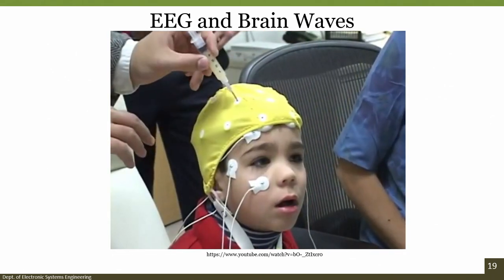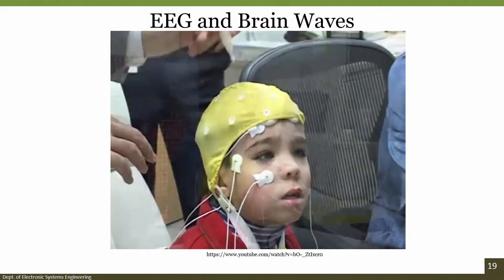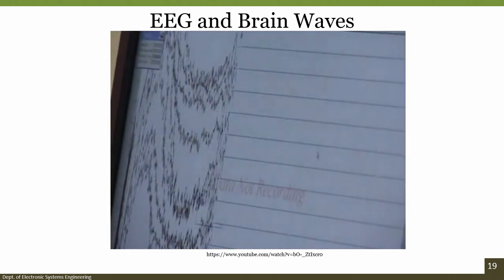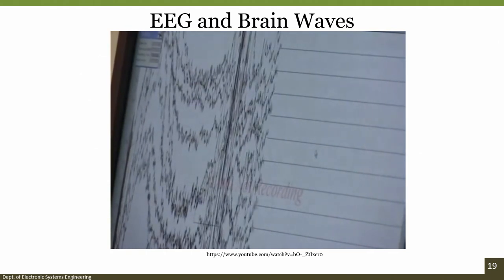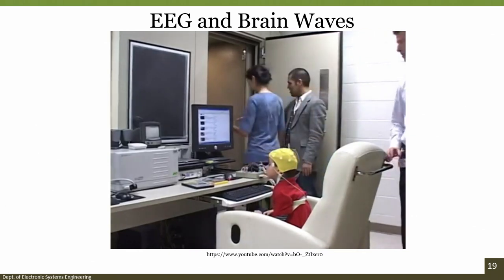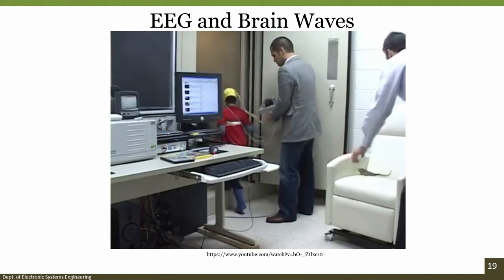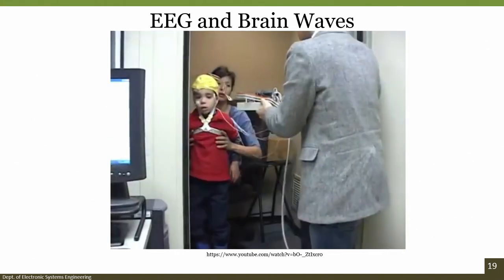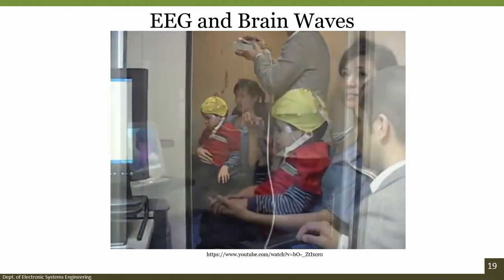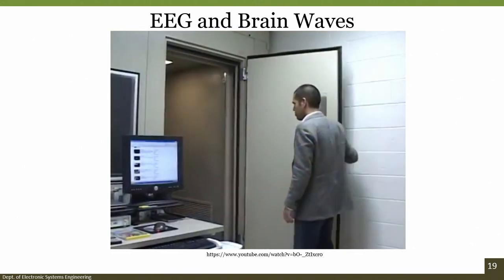After there's gel in all of the holes, you'll go into the little room to watch a video that you selected earlier. You can ask your mom or dad to come with you into the little room if you'd like. I got to go into the sound booth with him, which helped him feel relaxed. I thought it would be hard to help him stay still, but the room was calm and quiet, and we just sat and watched the cartoons.